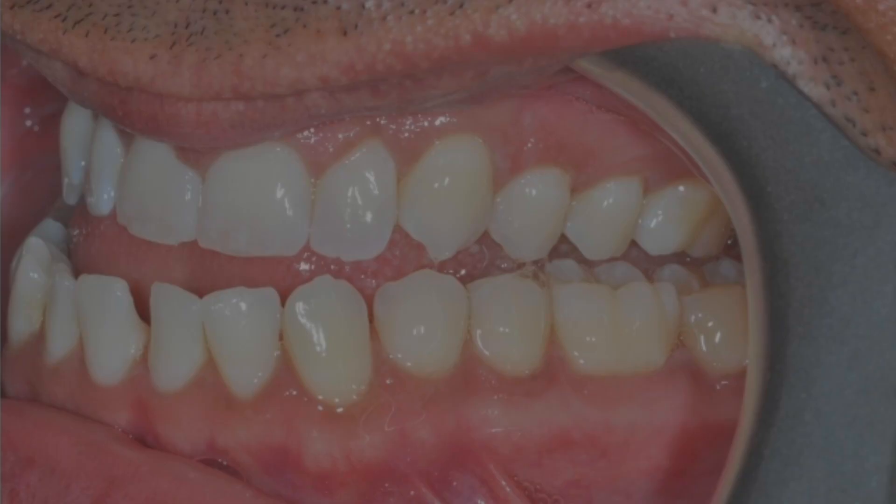Looking at the left side of James's bite, you can see there's a little bit of space between all of the back teeth — there are no contacts on James's left side, and that is definitely a problem. Those molars and premolars should be supporting all the forces of James's bite. James has strong muscles, but there are no back teeth to support the force generated by those strong muscles on his left side.